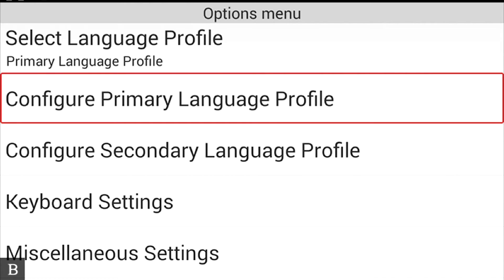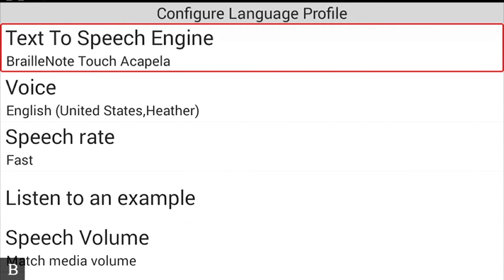Pressing next takes us to 'Configure Primary Language Profile,' which has a whole bunch of settings related to the language profile you're going to use. The first thing you can configure is your text-to-speech engine. One of the nice things about the BrailleNote Touch is that any user can go on the Google Play Store and download whatever text-to-speech engine they want. If you prefer Eloquence, you can buy it on the Google Store — I think it's $20 US. In this case, it comes with BrailleNote Touch Acapella.